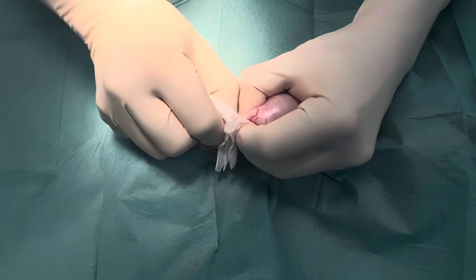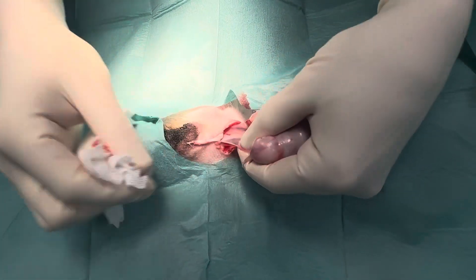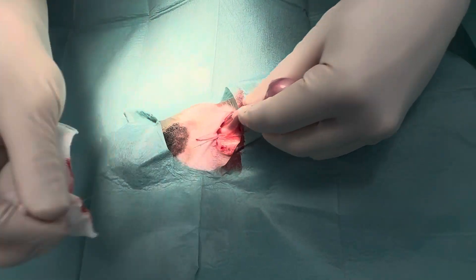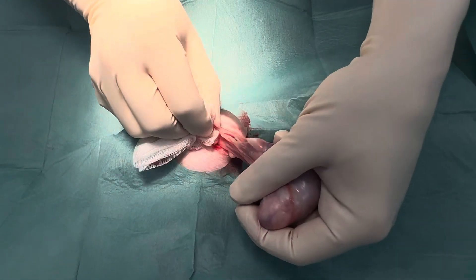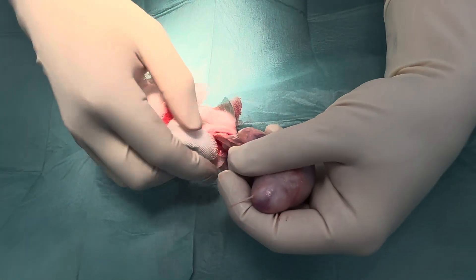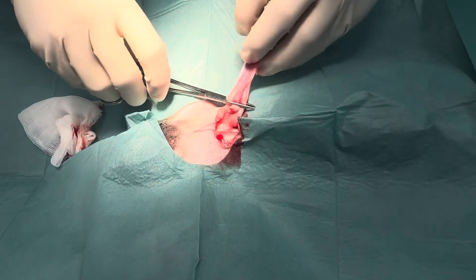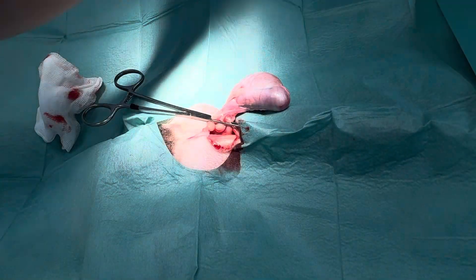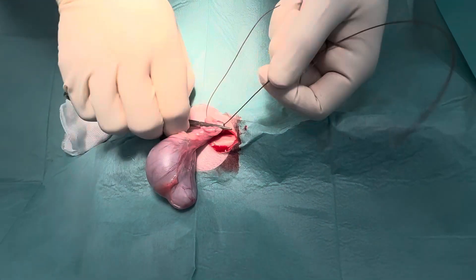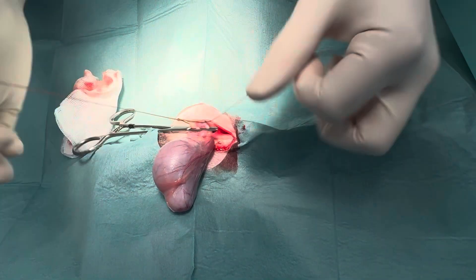I usually use a gauze or swab to break down some of the ligament here, avoiding any major blood vessels which you can see inside. I want to remove as much of that tissue as possible until you've got a nice view of the major blood vessels. Then we're just going to do an ideal one-clamp technique. I'm going to grab some catgut — I routinely do two ligatures for these, as it's a high movement area and there's a higher risk of ligature breakdown if the dog is reactive.